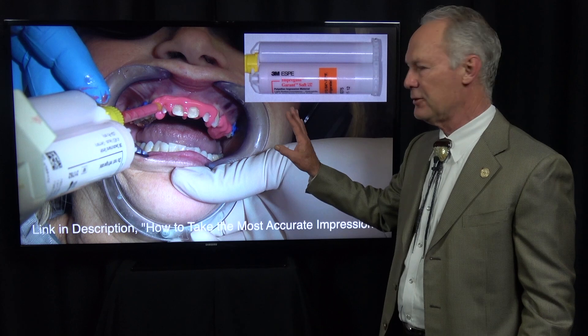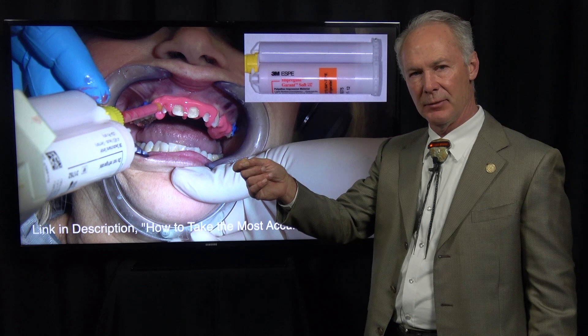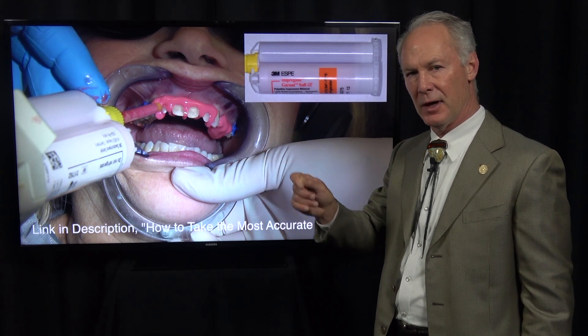I'm removing the cord now. Be sure the cord is wet when you're removing it. If it's dry, it may tear the tissue and cause bleeding.